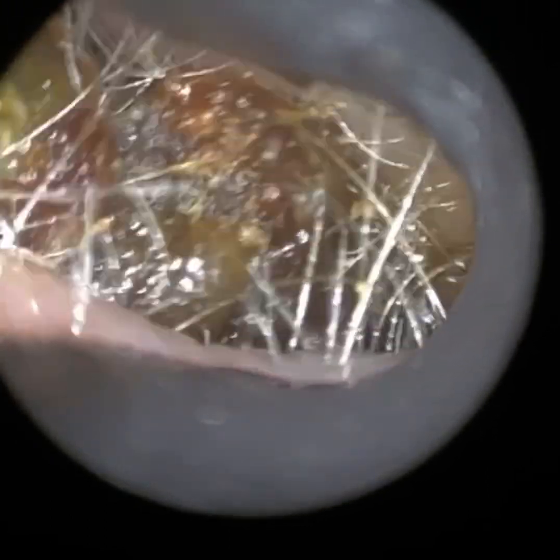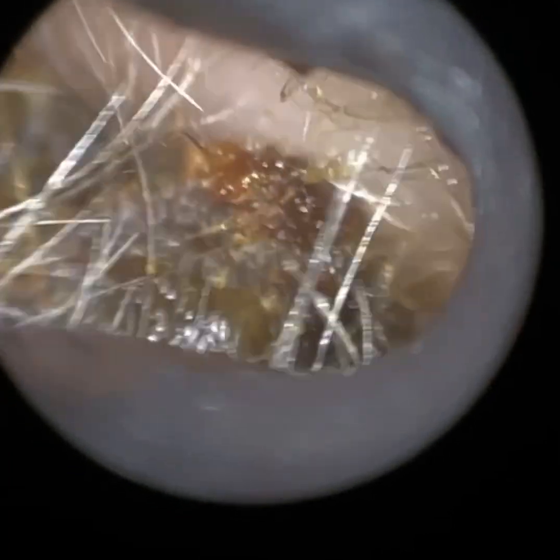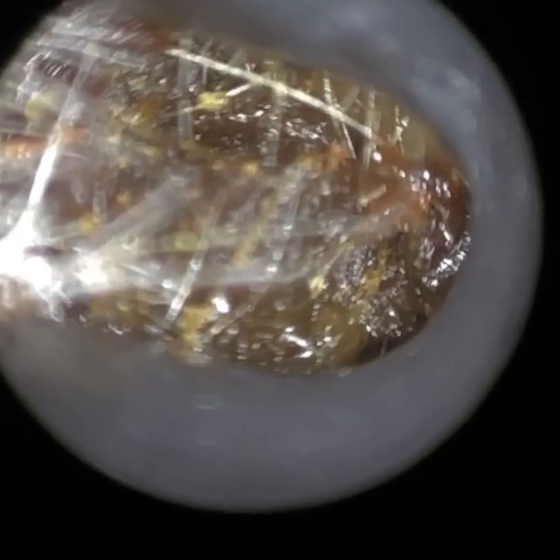Once more, this wax plug is just stuck at the entrance now. We're just trying to tease this through — we're nearly there. I'm just trying to stretch this ear open, just to open up the canal so we can get this wax plug out.